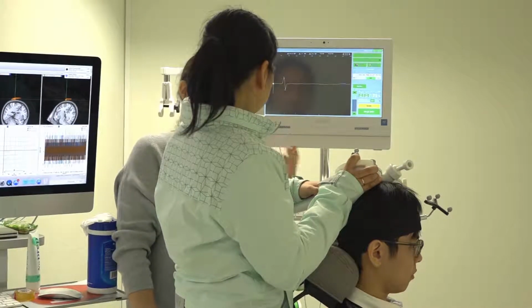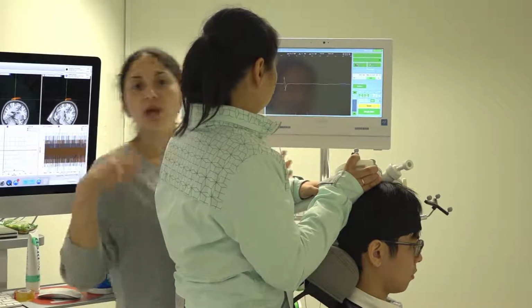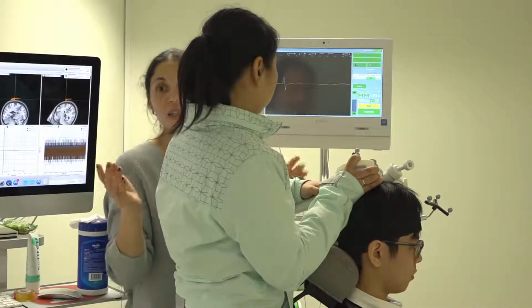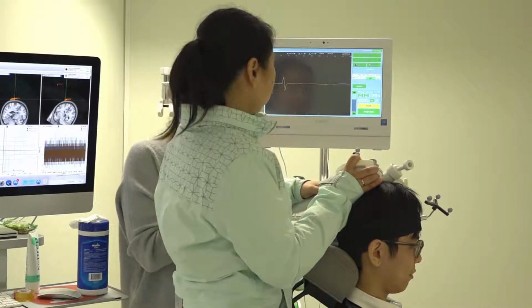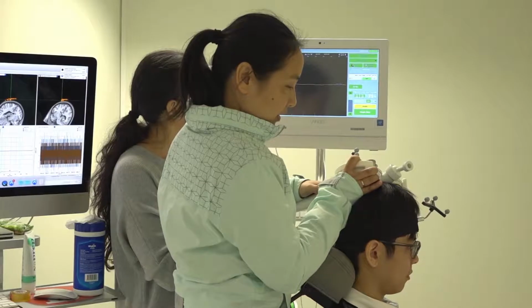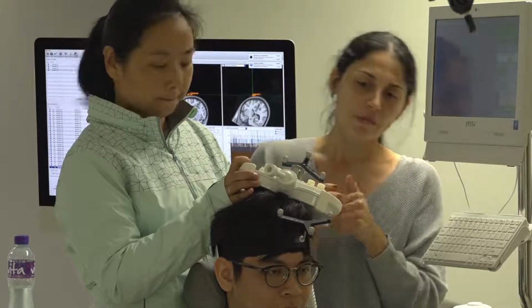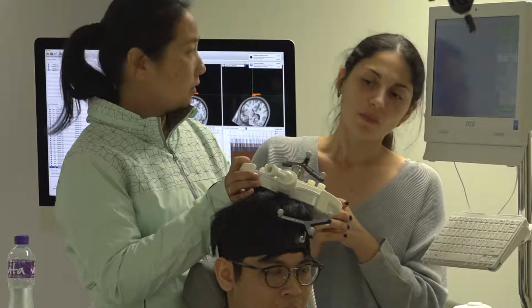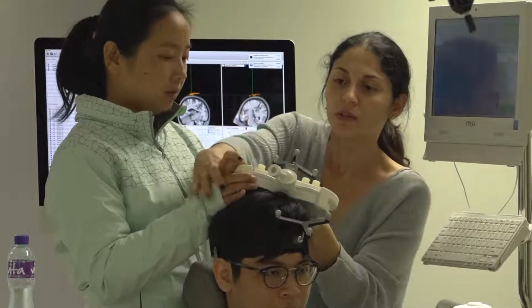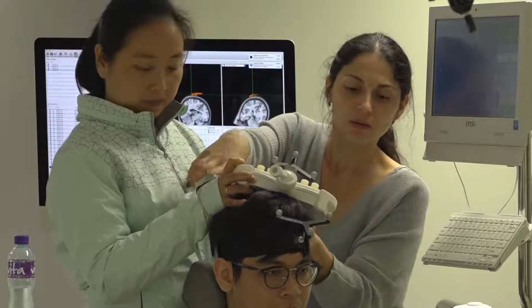When you are doing it, it's more difficult, no? I mean, how do you see it when I'm doing it? It looks easy? Oh, no. Well, good that it doesn't look so easy because it's not. Yes, because my legs are trembling a little. Okay, good. Probably if you do like this and you hold it like this. Yeah, try.